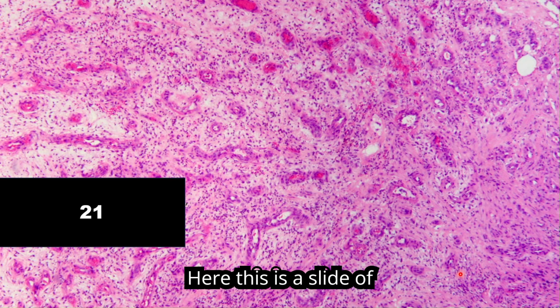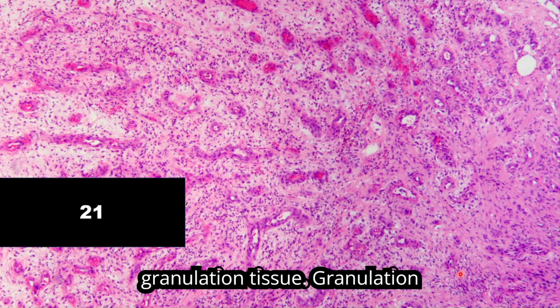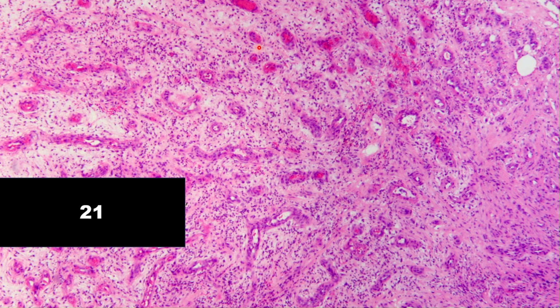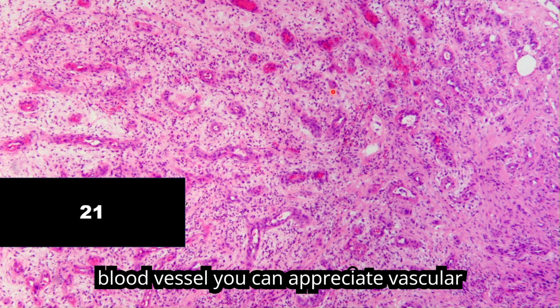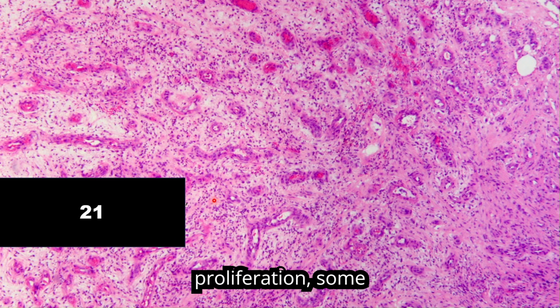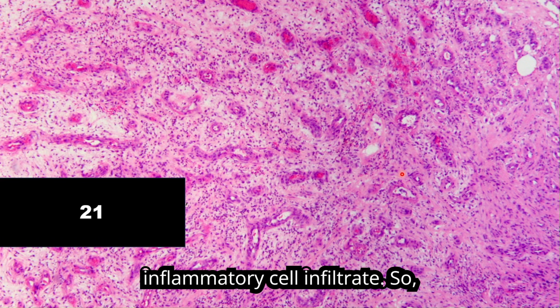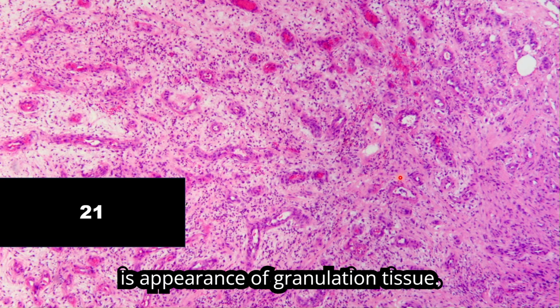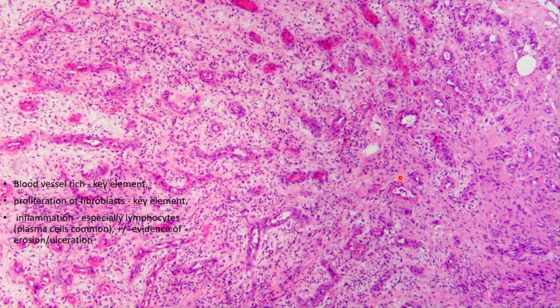Okay. Here this is a slide of granulation tissue. Granulation tissue comprises three elements: vascular proliferation, where you can appreciate small blood vessels, some fibroblastic proliferation, and these are the inflammatory cell infiltrate. So whenever there is a healing phase, there is appearance of granulation tissue.